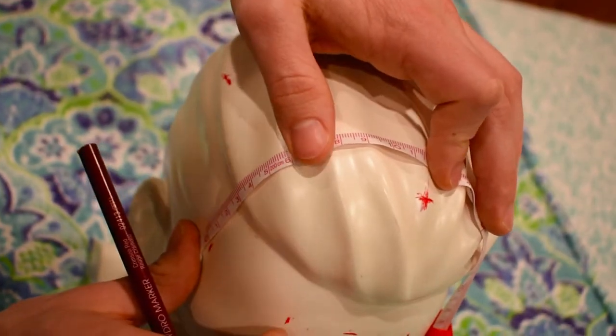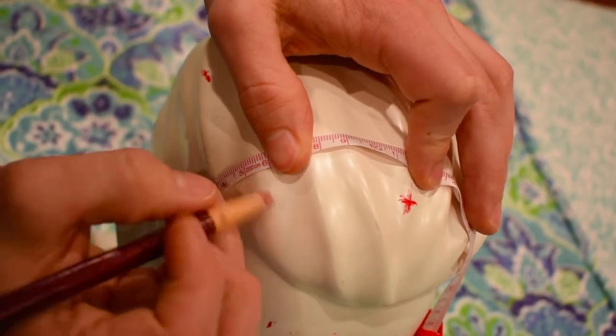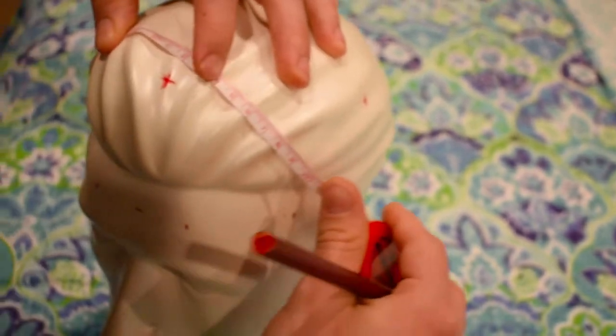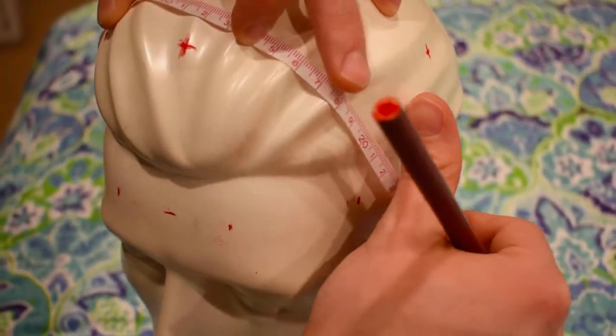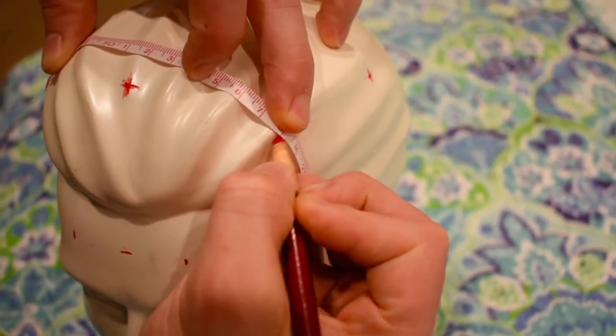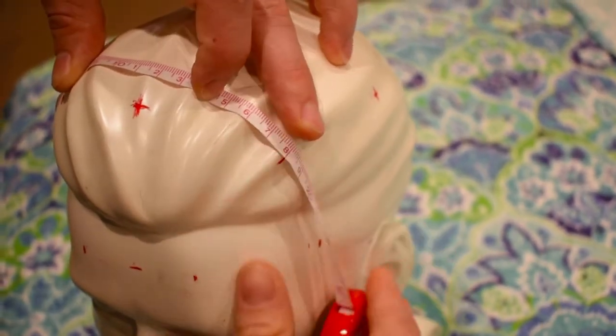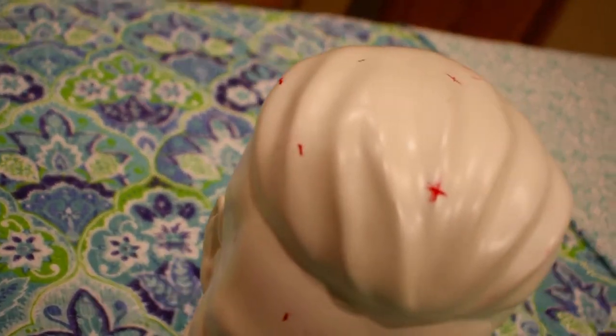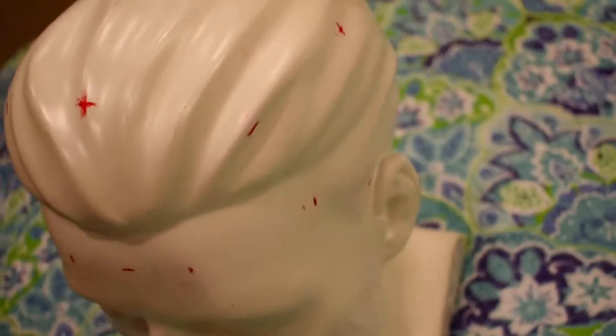So 6 up, and we're going to do 6 down, which is going to be 18. And that's our 2 markings for F4 and F3.